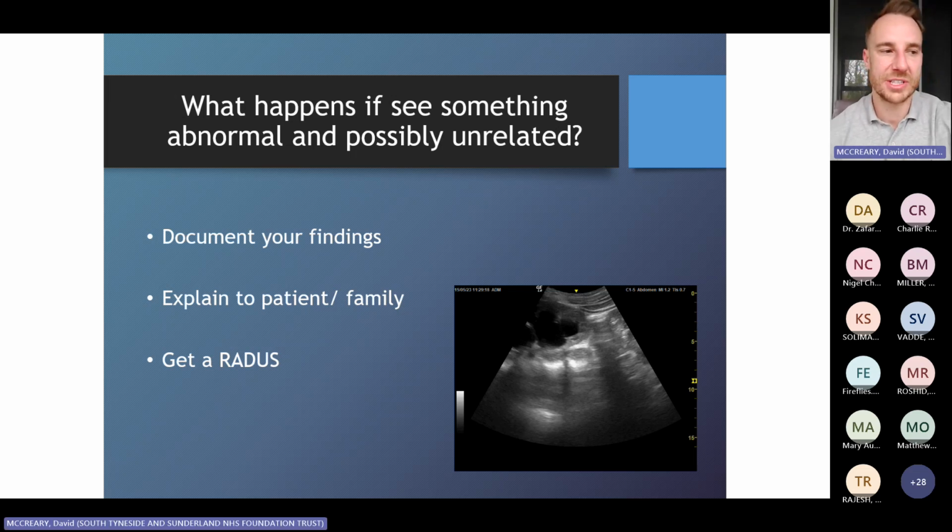We can never think of POCUS as being a comprehensive assessment. That's not why we're employed by the trust. We're not there to do that for the patient. We don't have all of the expertise to do it or the correct equipment. So I never think that that's what I need to do. But equally, if we find something really unusual, like a metastatic tumor in the liver, which unfortunately I had recently, we can take the correct action, I think. So we're always going to approach that in a governance-sound manner and probably do the right thing.